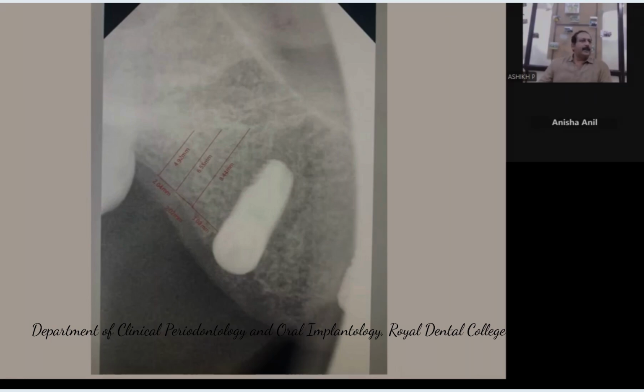What is the minimum size that you have in the length? Length, you have got 4.25 into 6.5. So your 6.5 length starts from 4.25. You don't have a 3.75 in the shortest lengths.